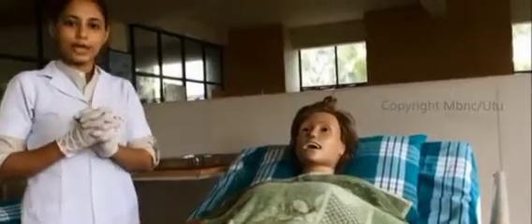So after the comfortable position, we have to spread the Macintosh with the towel on the chest of the patient for the prevention of wetting. Then we have to do the hand washing. I have done hand washing.